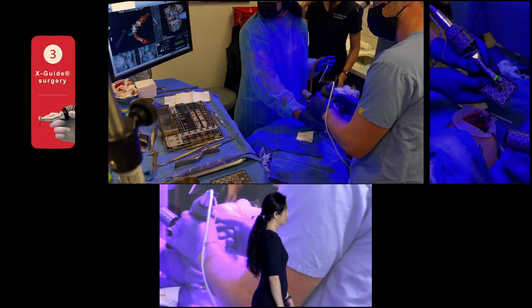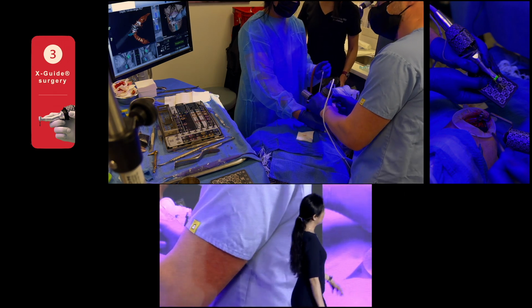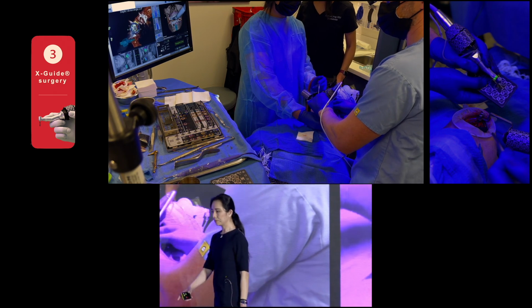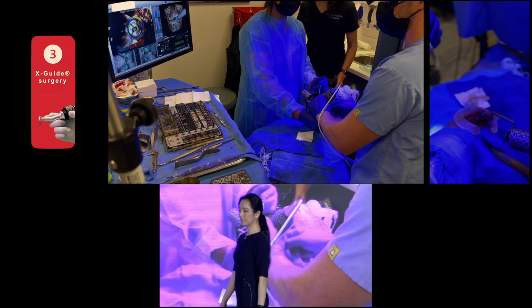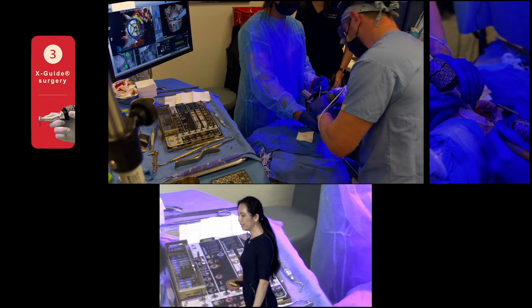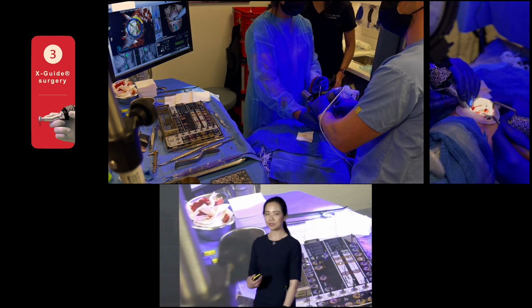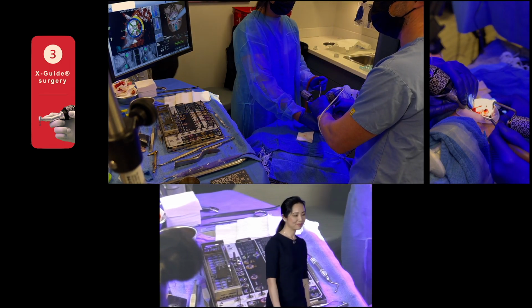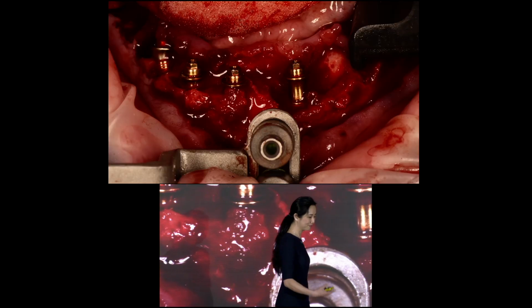So this is what calibration would more or less look like. Basically, the idea is that both of these pads have to be visible under the scanner before proceeding. And when in doubt, he'll calibrate again. So if you were to watch his entire surgery from start to finish, he probably calibrates about 15 times to place 4 implants because he was being extra careful.